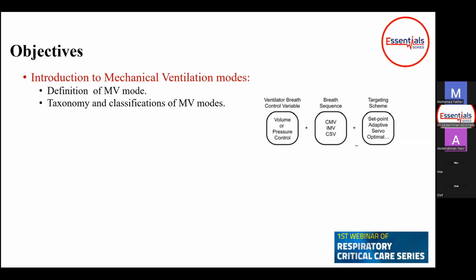So it became very essential to know the classification and the taxonomy of mechanical ventilation modes. How do we classify the modes? How do we cluster them? What modes are like each other, and what modes do not look like each other? So the taxonomy and classification of mechanical ventilation modes has become an essential part of the training of the respiratory therapist, the intensive care doctor, and the pulmonary physician.